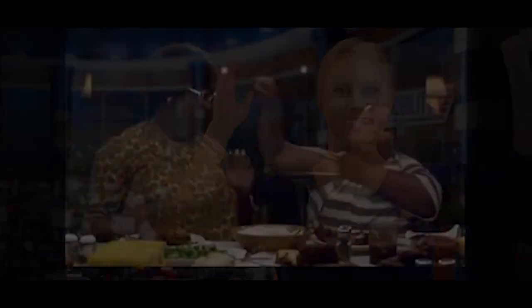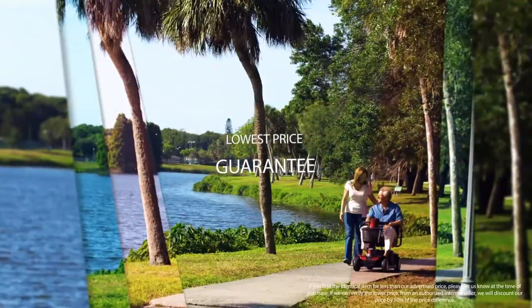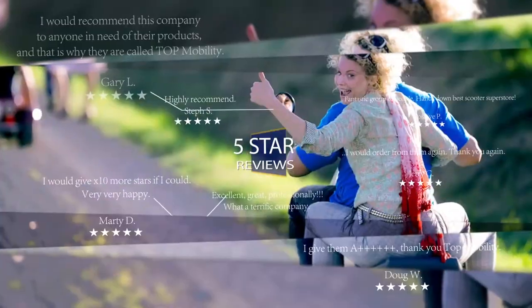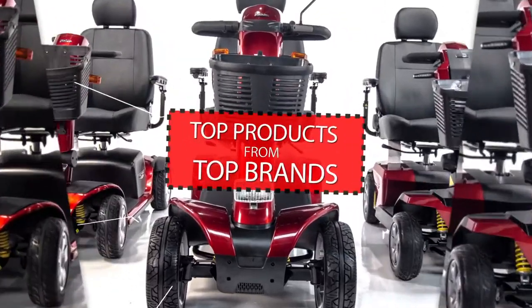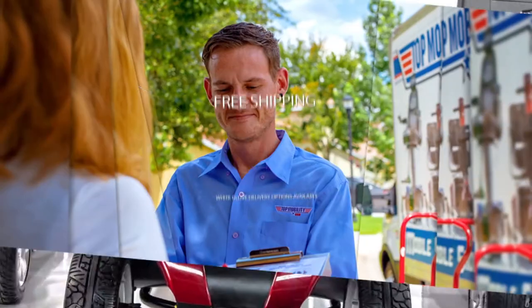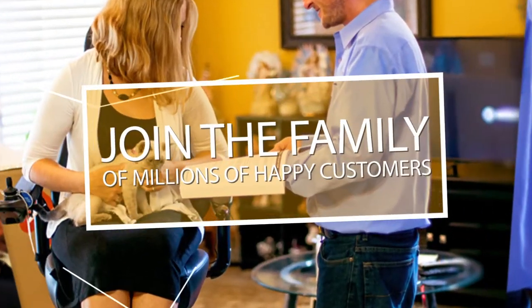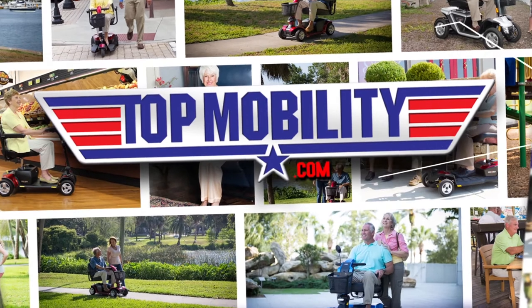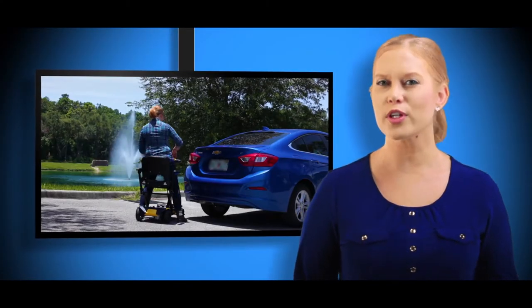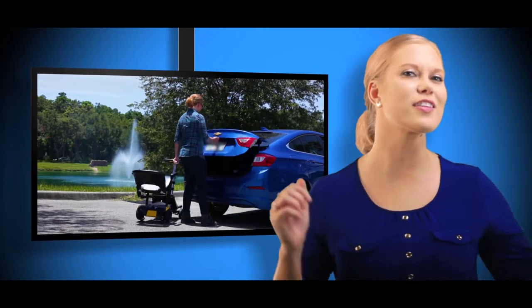Introducing the Hercules lift! The Hercules lift puts your folding scooter into the trunk for you. No more heavy lifting for you — the Hercules does it all.